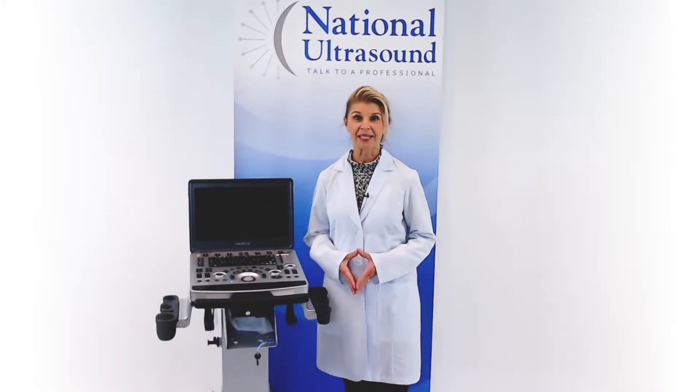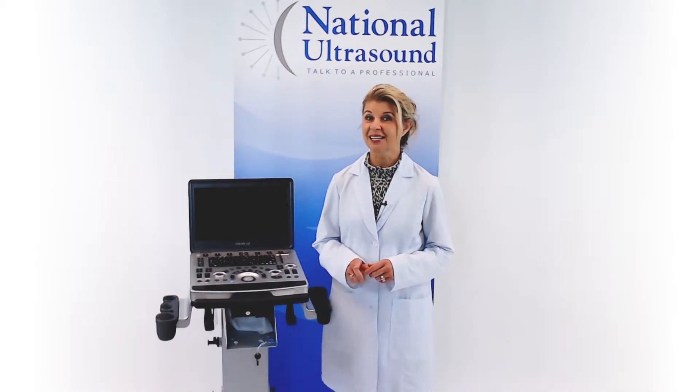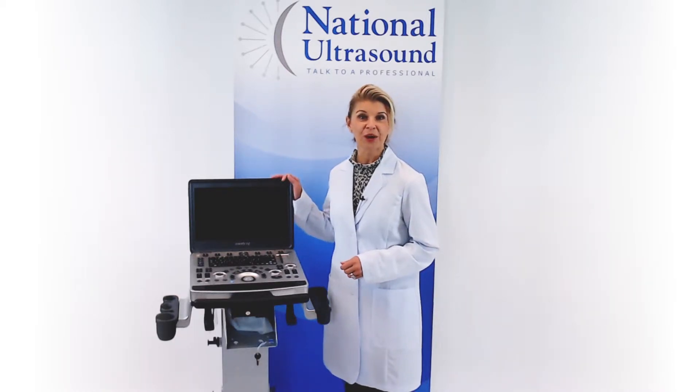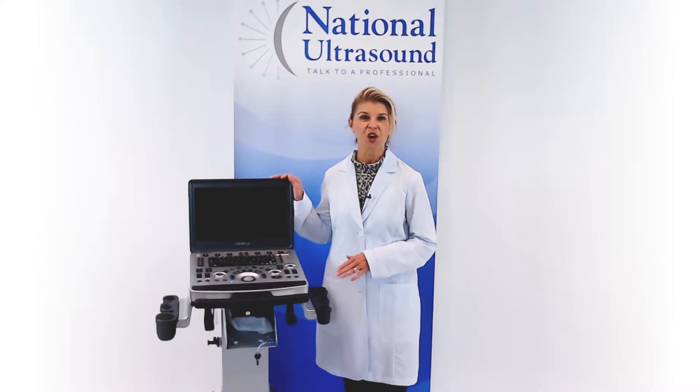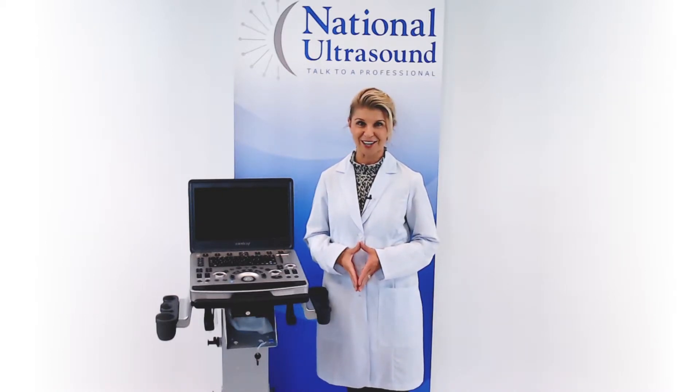Hi, my name is Brandy Benz and I have over 27 years of experience as a sonographer. Today, I am reviewing the Mindray M9 Ultrasound Machine with High Dynamic Range Color Flow Doppler. The M9 offers a high-performance platform based on advanced technologies.